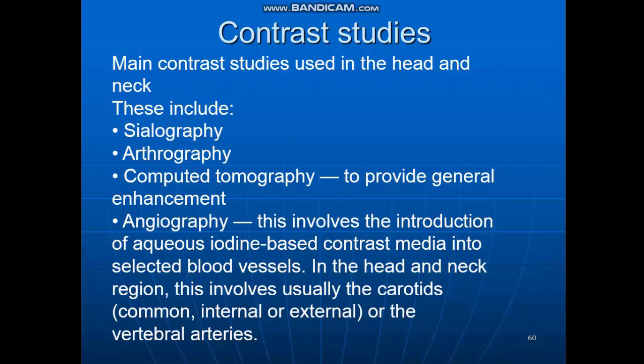This involves the introduction of iodine-based contrast agent into selected blood vessels in the head and neck region, usually the carotids, sometimes the internal or external carotid artery, or the vertebral arteries.